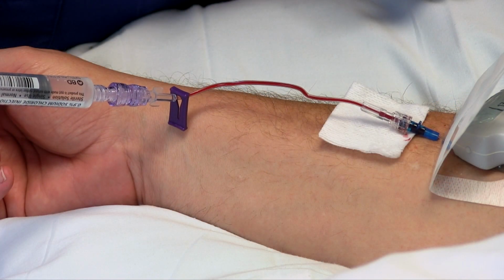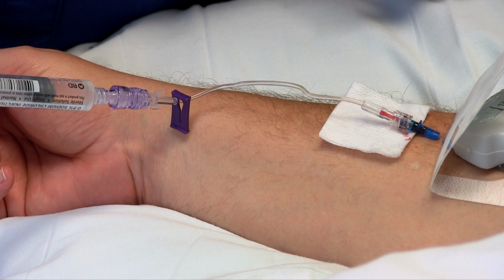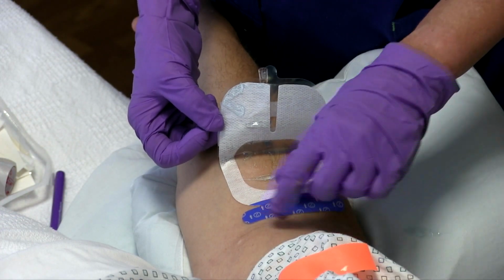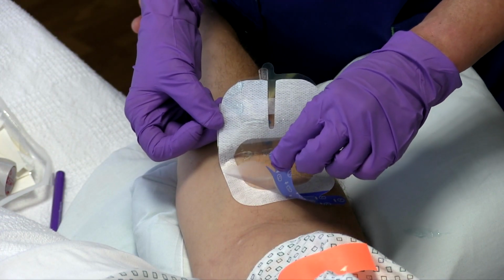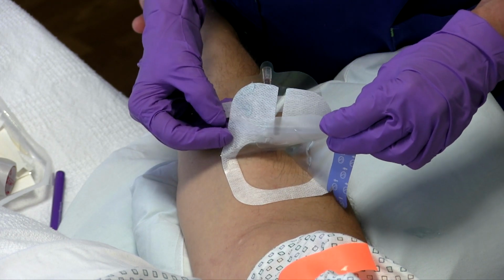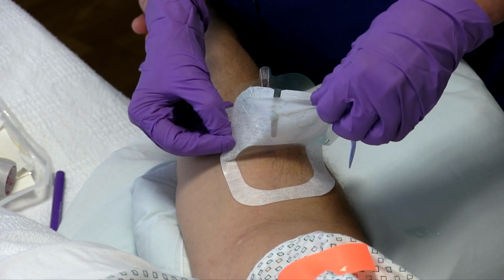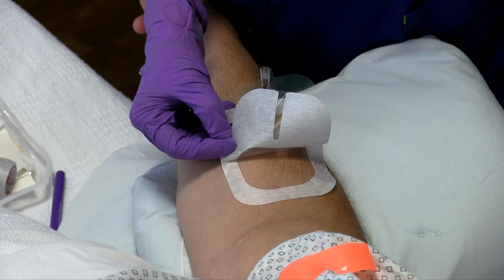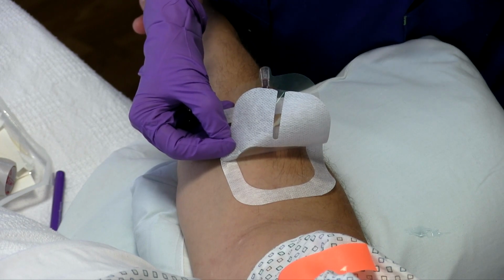Once the placement of the intravenous catheter is confirmed by flushing, grasp the blue tab on the rear portion of the dressing, indicated as number 2. Pull away from the dressing and remove the top layer where the gel was placed. Discard the film cover and the gel. No further cleanup is necessary.